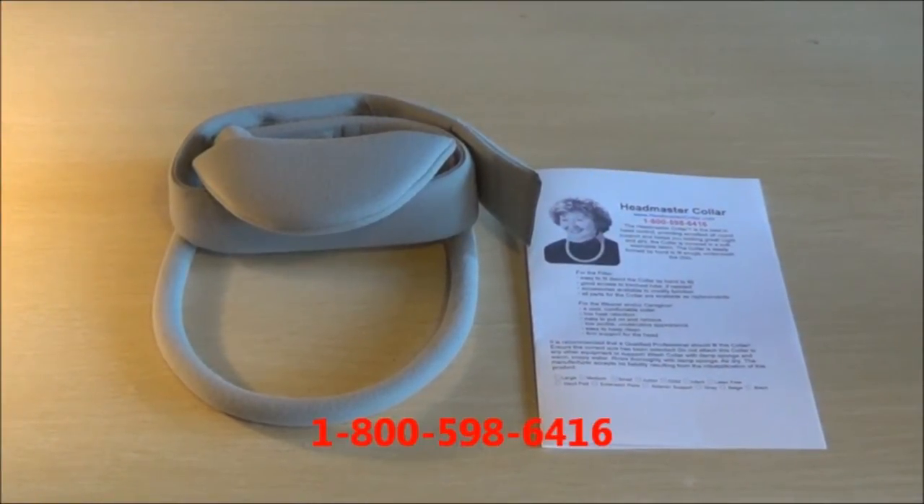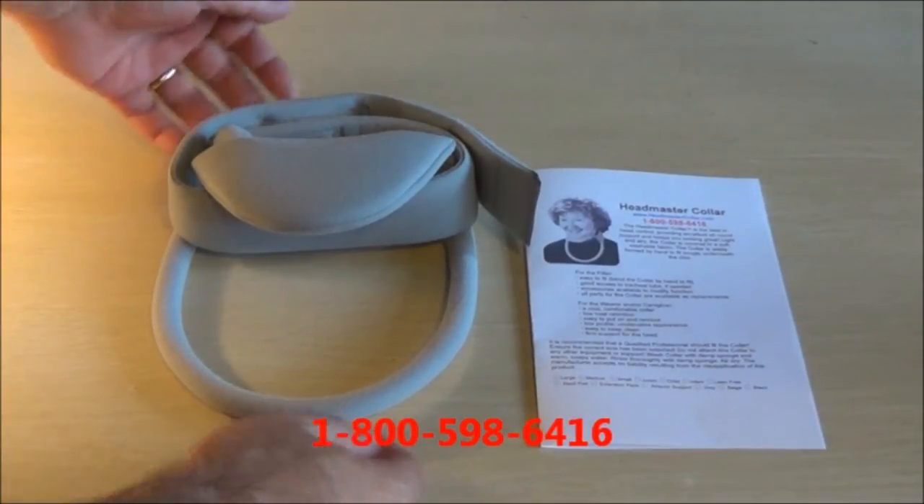This is the Headmaster Collar from headmastercollar.com, used for holding up the head for conditions like ALS, Parkinson's, and general conditions where there's a lack of control of the muscles in the front of the neck.